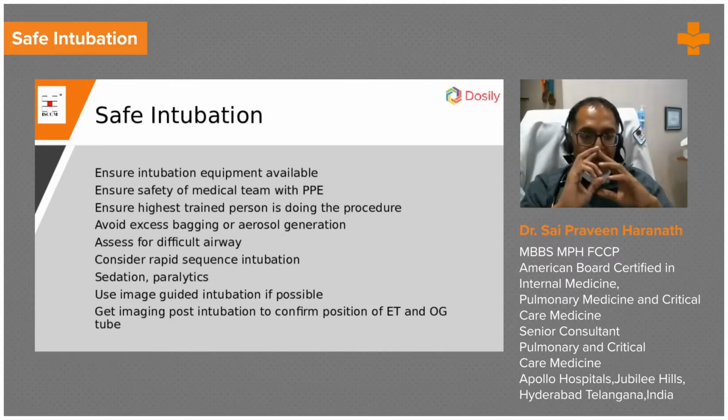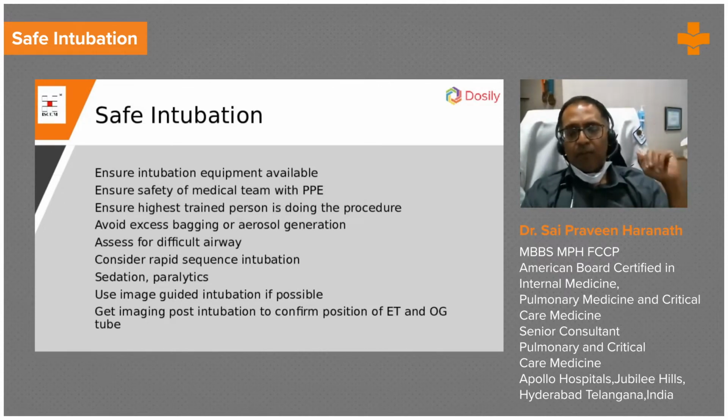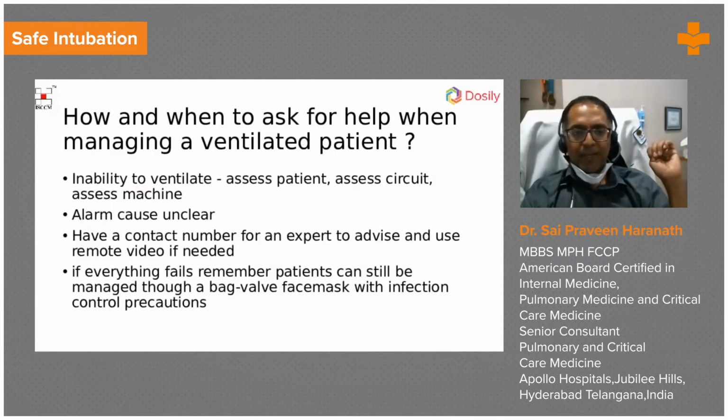And you may have to get a chest x-ray, obviously, after the intubation to confirm the position of your endotracheal tube. And also, if you're putting a nasogastric or an orogastric tube, preferably an orogastric tube, into the stomach, you can get an x-ray to confirm that.